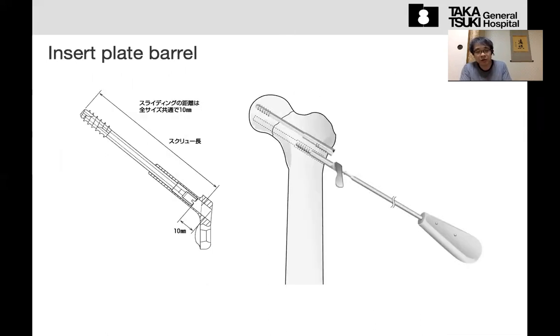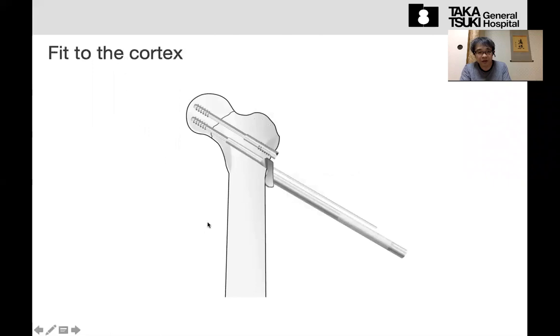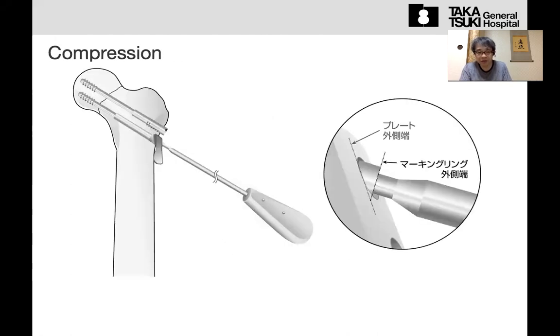Then remove this stabilizer and replace it with this plate barrel. Insert the plate barrel and fix the screw. Again, after the screw reaches its longest position inside the barrel, carefully turn the screw, and the femoral head comes closer. That can cause the fracture compression. So this is the static compression.